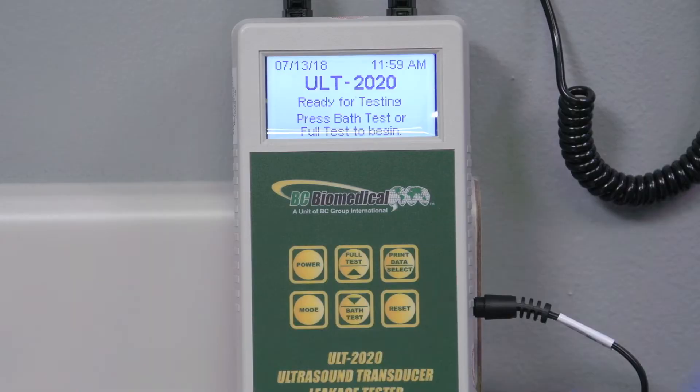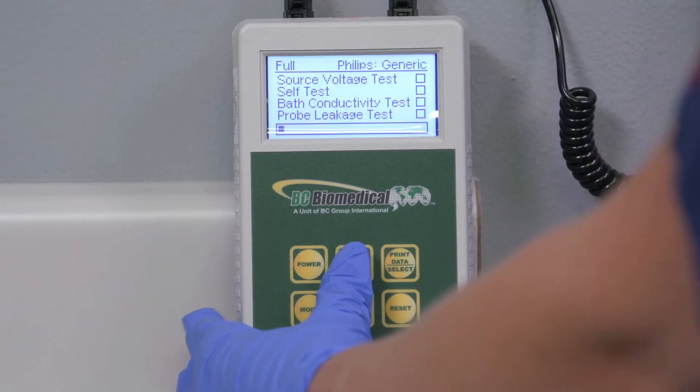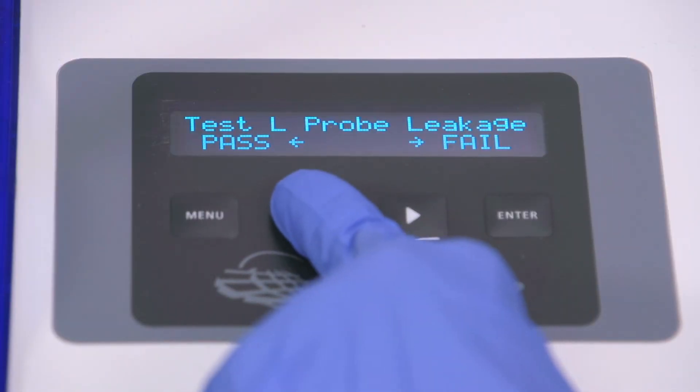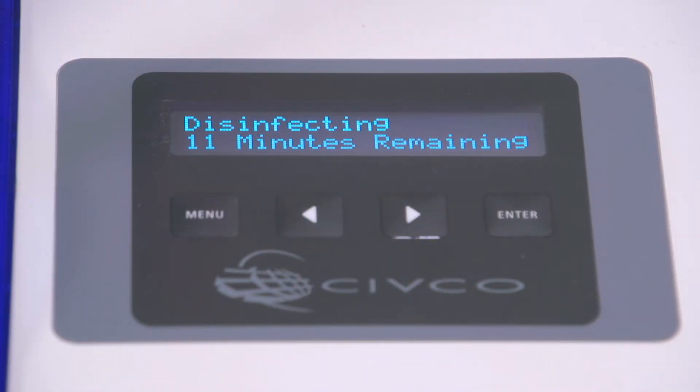The meter will perform its reading. Observe the leak test result on the leak tester display and enter the results by selecting the Pass or Fail button. After you press the Pass arrow for the first probe, you can proceed with leak testing the second probe, or you're done and can leave the system to reprocess the probe.